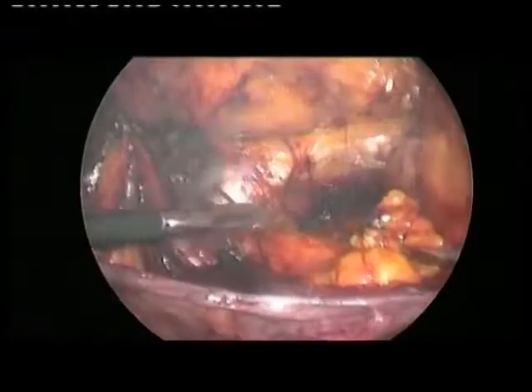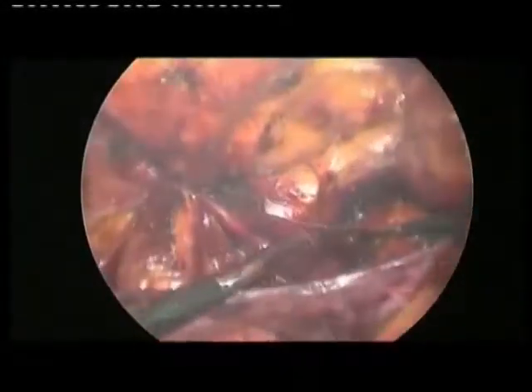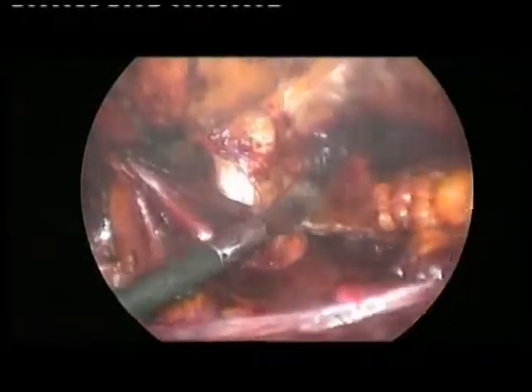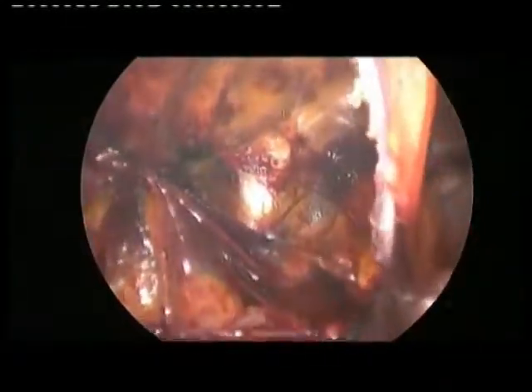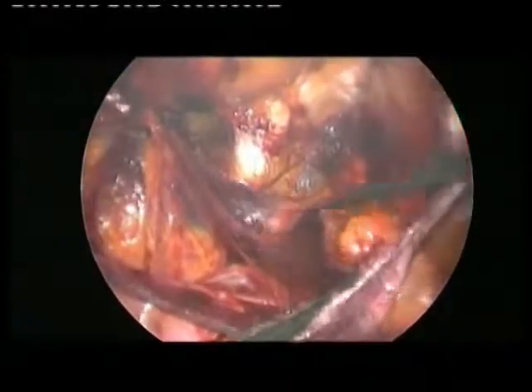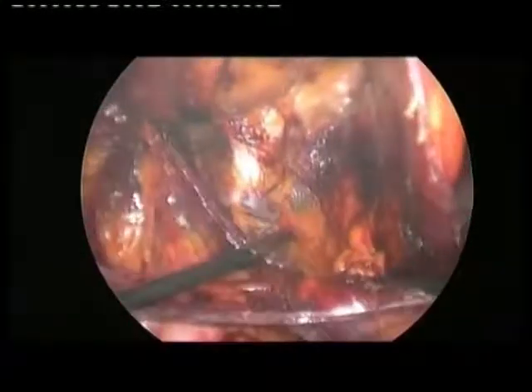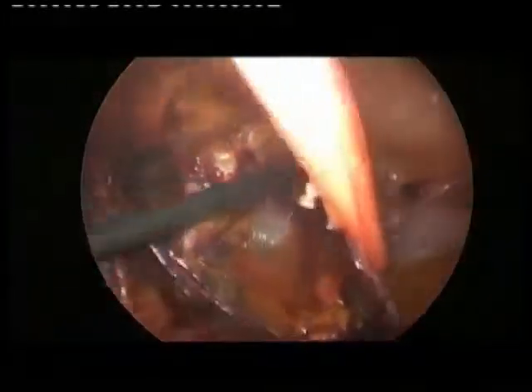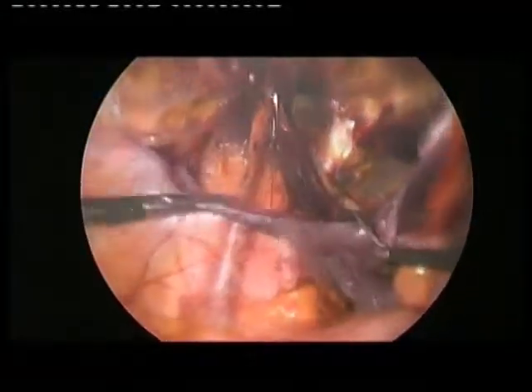I try to be very clean, okay? Go inside. You see, the view with 5 millimeter optics is very good. I'm doing now colon resection too with 5 millimeter optics without any difficulties. Okay. I always prepare a few centimeters below the Cooper ligament so I can put the mesh. Okay. So now preparation is almost finished, you see?